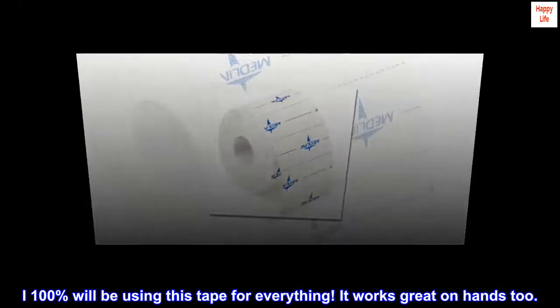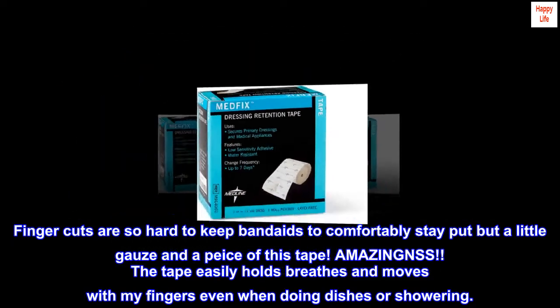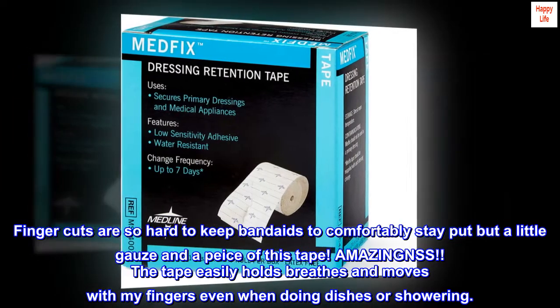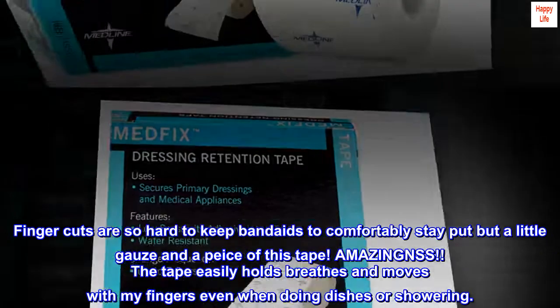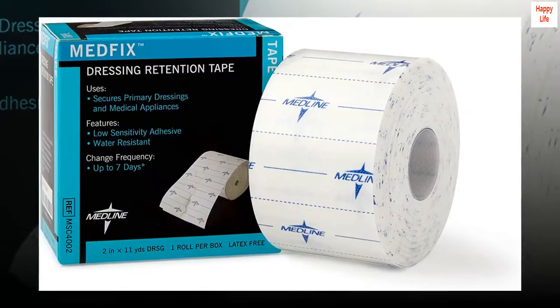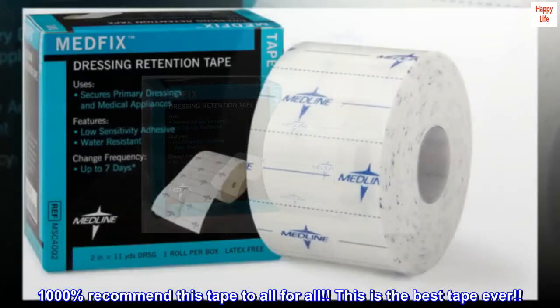It works great on hands too. Finger cuts are so hard to keep band-aids on comfortably, but a little gauze and a piece of this tape — amazingness. The tape easily holds, breathes, and moves with my fingers even when doing dishes or showering. 1000% recommend this tape to all. This is the best tape ever.